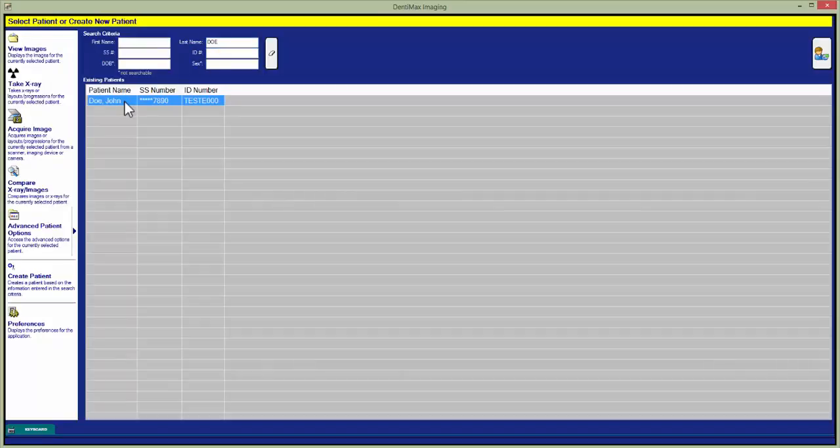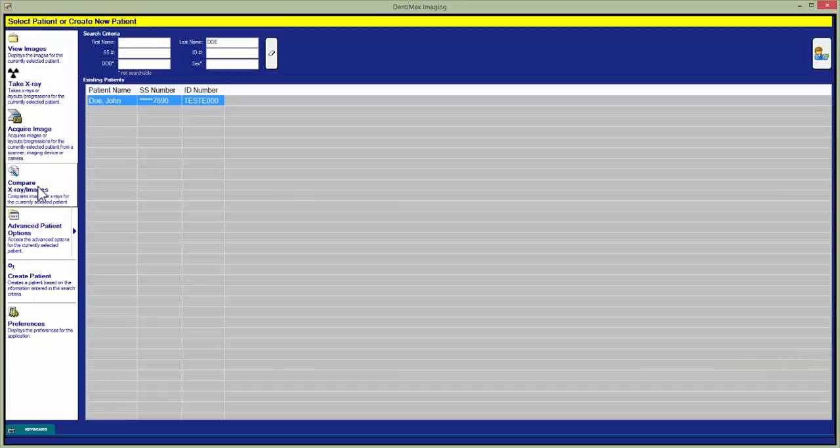Once we have our patient selected in the left hand column we'll see the middle button is compare x-rays slash images. We just need to select that button.